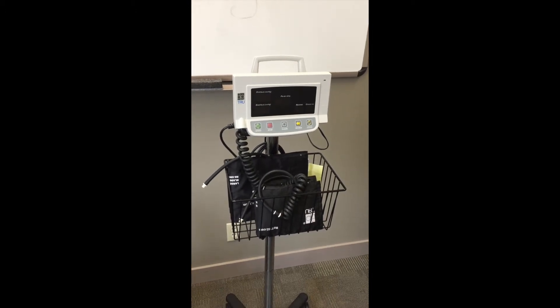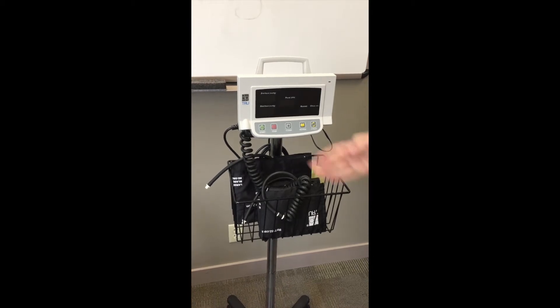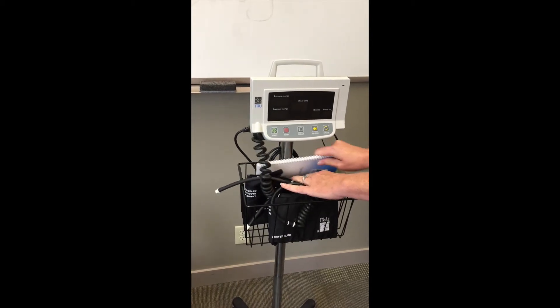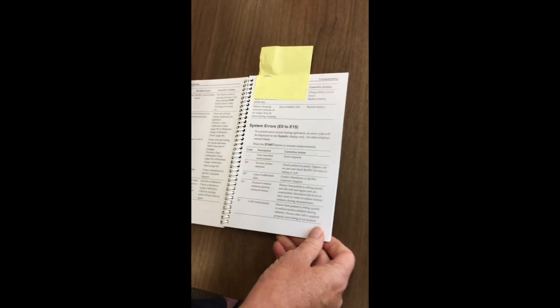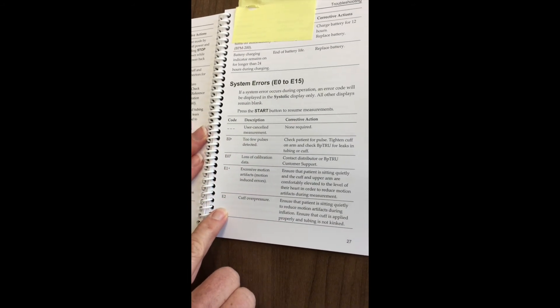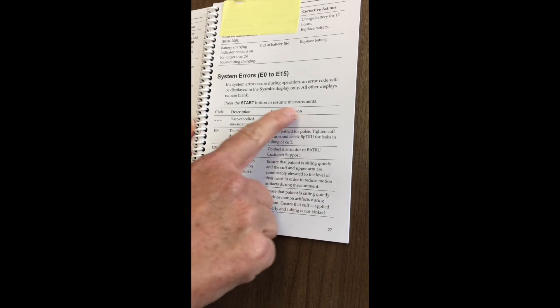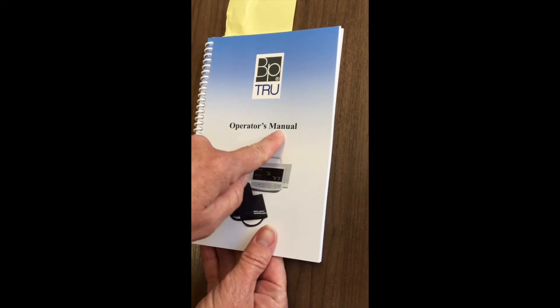Sometimes you will have other issues with the machine that you're unable to solve by recalibrating it or ensuring that the cord hasn't been twisted. At this point you will have to remove your manual from the basket and open it to where it says system errors. This will show you all the error codes that will come up on the machine, a description of the problem, and the corrective action — how to fix it. Once again, that is in your BP TRU operator's manual.